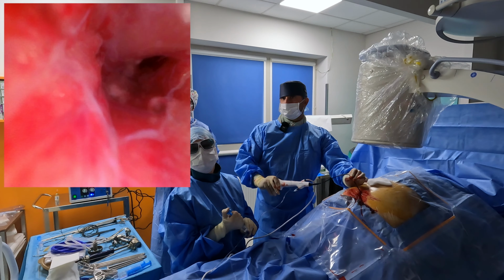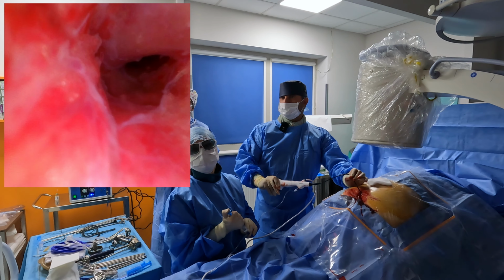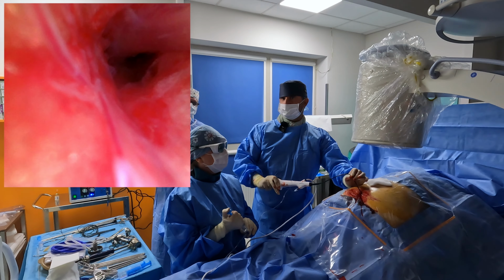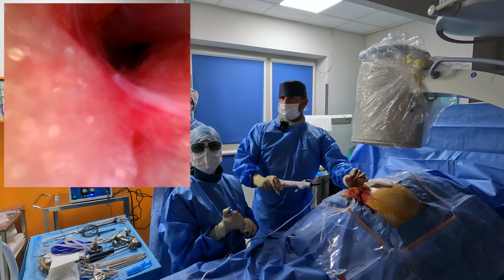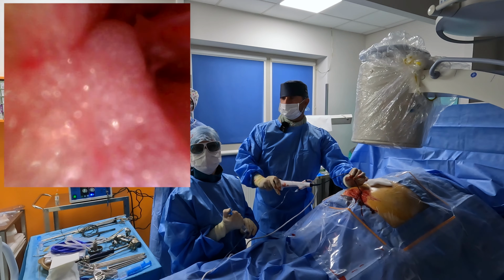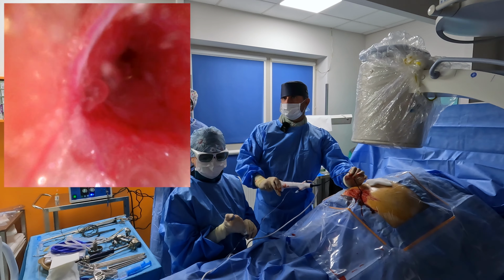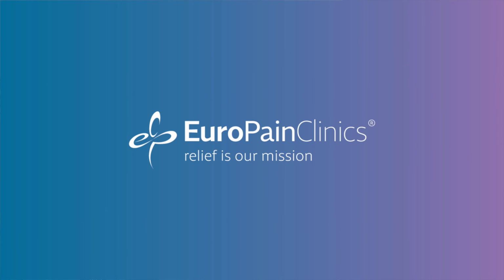I carry on. Nothing special here, no bleeding. You also have a possibility to check the whole way down if there is any bleeding, and if there is no bleeding, you know that you are not supposed to expect any epidural hematoma. Slowly coming out, and we are finishing the procedure.